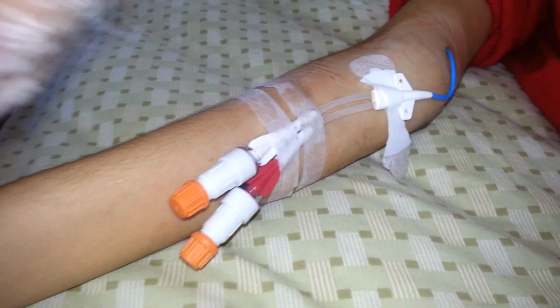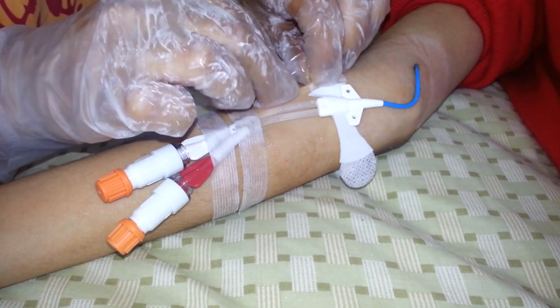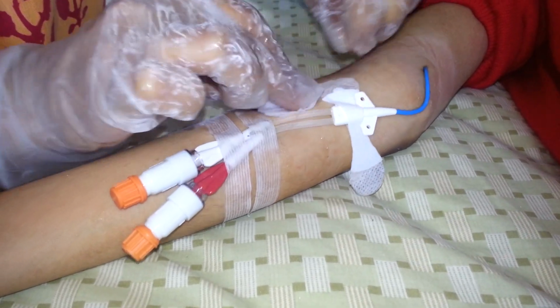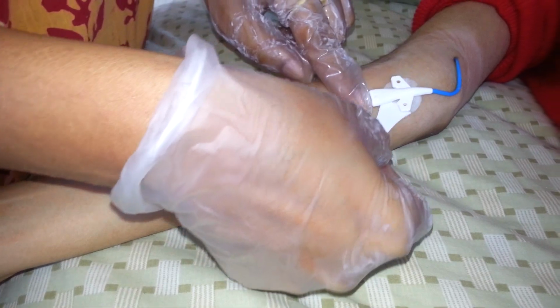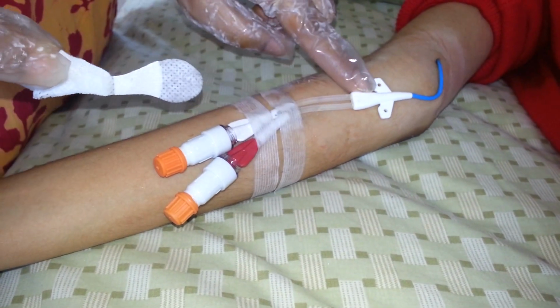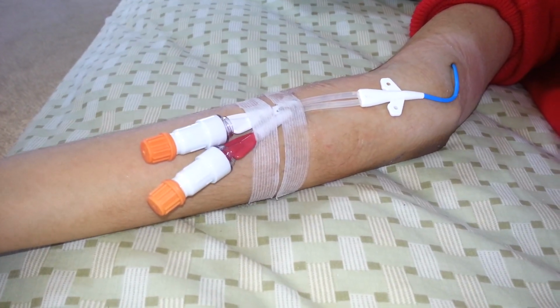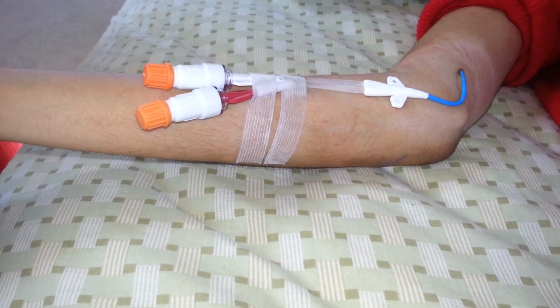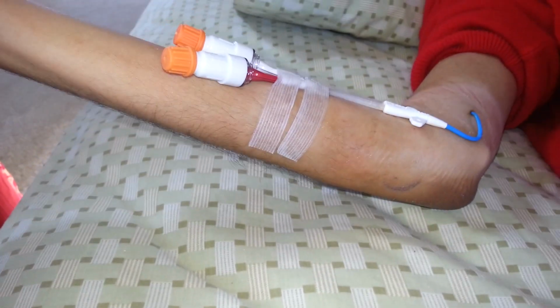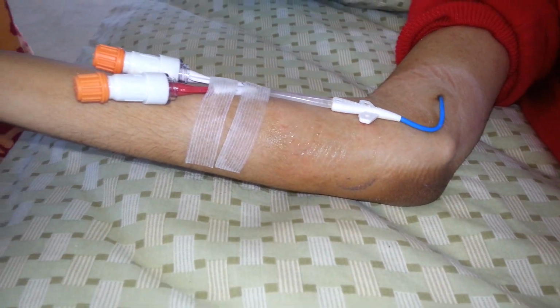Now we will remove the Griplok using the swab very gently. Loosen the Griplok from both the sides. Open the wing and very gently pull it out from one side. Make sure that the catheter is in place. Once the old dressing is out, I examine it. I examine the site for anything unusual like redness, swelling, pus or any other discharge. The site is looking good, and we will proceed with cleaning the Picc line site.